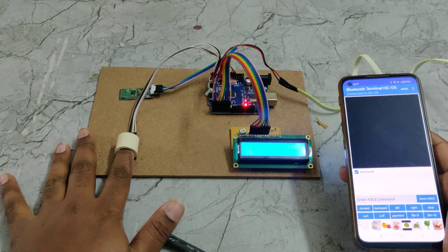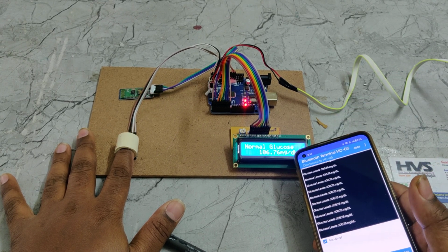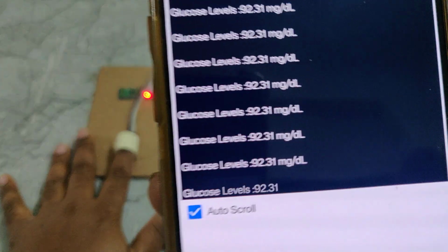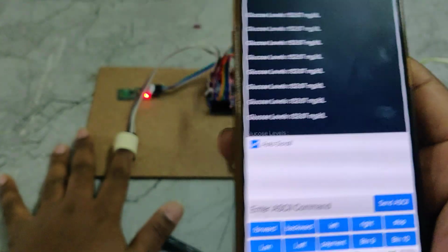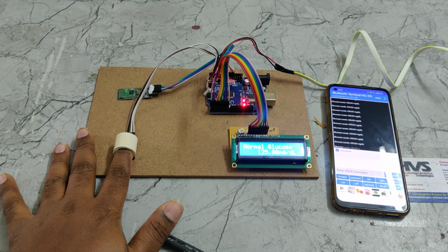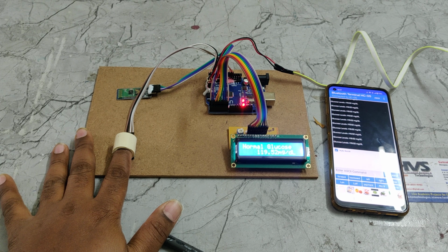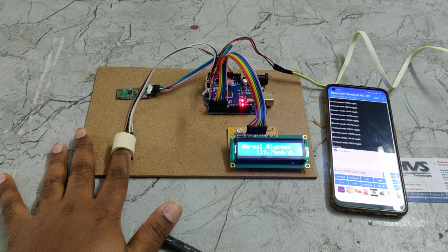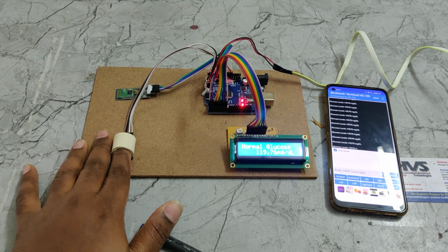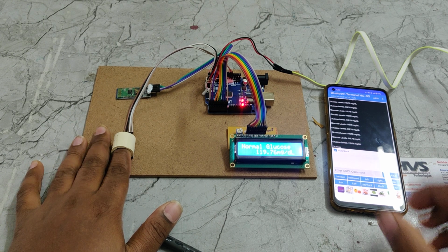Place the finger and leave it for at least 5 to 10 seconds to stabilize. Once the finger has stabilized, we can see the sensor's data over here. If you move the finger, the data also varies with high differences. Once stabilized, we can see it's around 119, 113, 114, 106, like that. It will be locked somewhere nearby. If you move the finger heavily, like I'm moving it now, the readings may shoot up very high or very low, or you may not get any response at all.